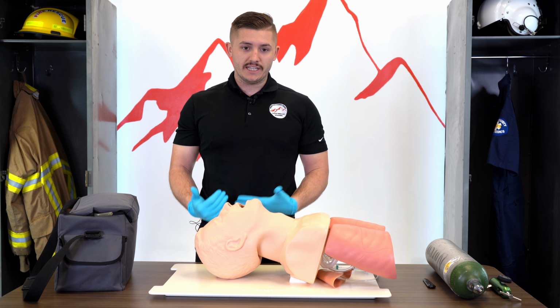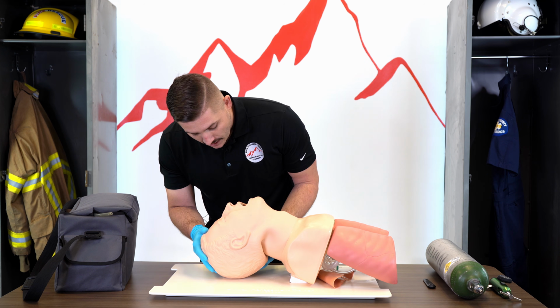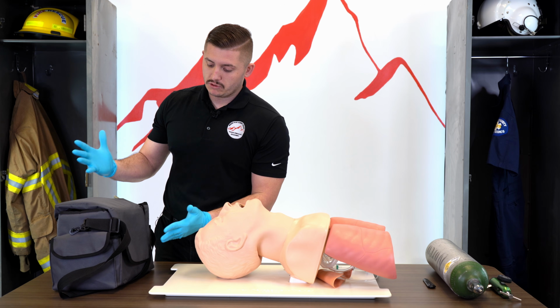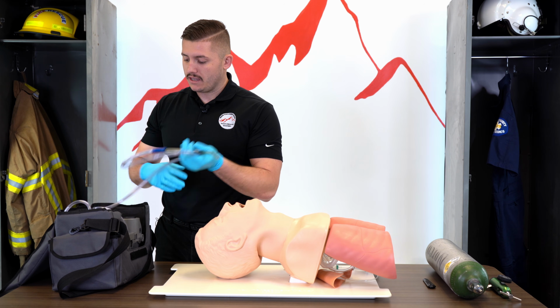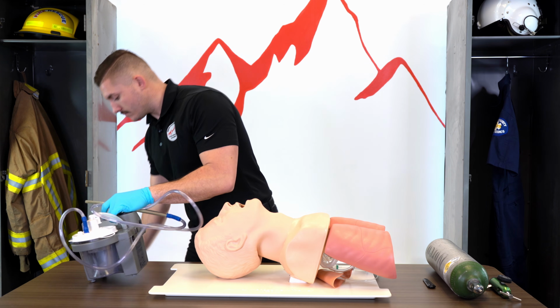So what I have to do as an EMT is now suction the airway. So I'm going to do my head tilt chin lift. I notice I have secretions in the airway. I'm going to now suction. So I'm going to get my suction kit out. Typically, you'll see it in some sort of bag or kit like this. Flip it open. You can leave your suction machine in the bag if you'd like. Some people will actually take it out of the bag.